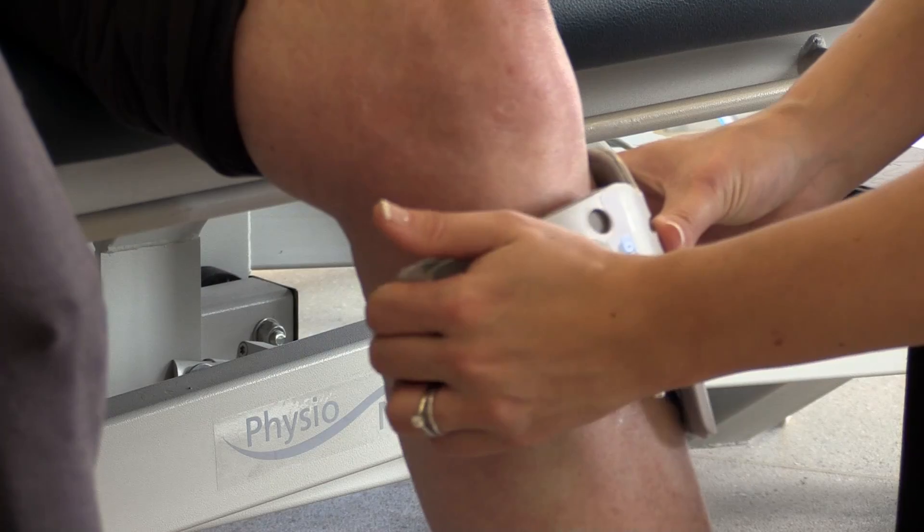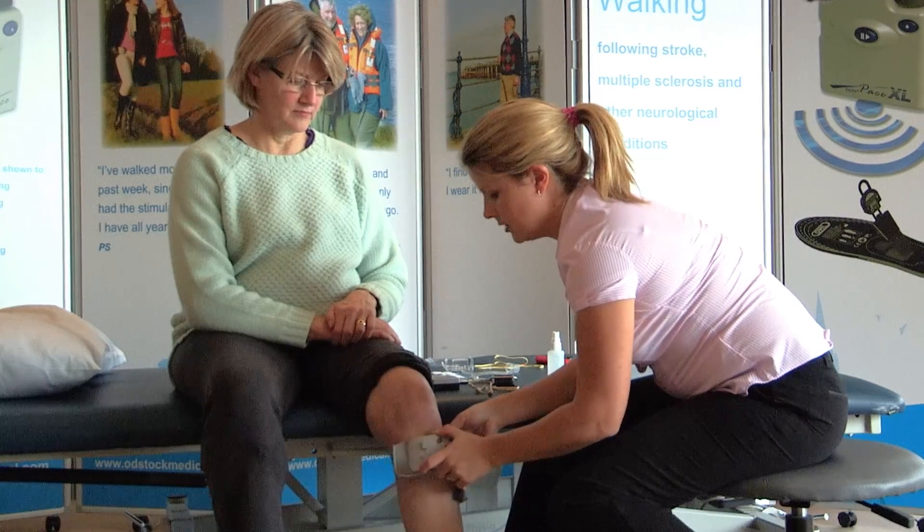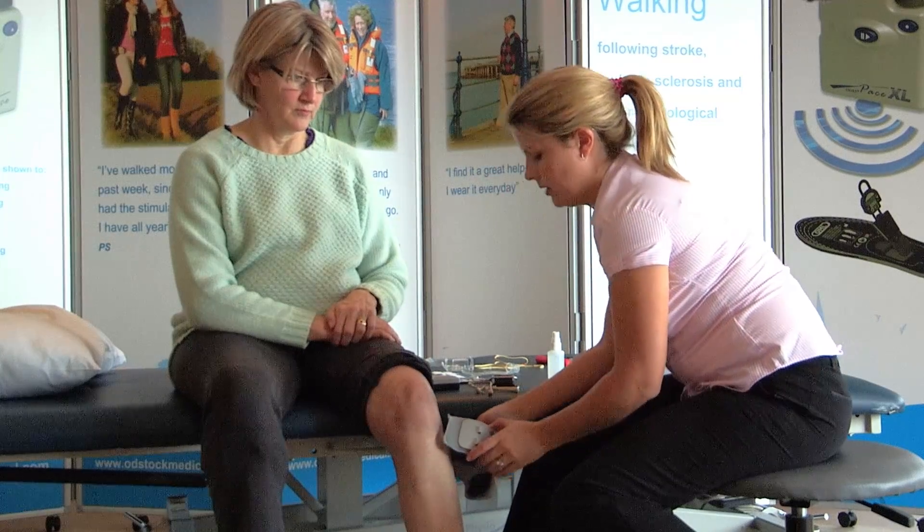Once you're happy, gently peel the leg cuff off the leg, encouraging the electrodes to come away with the leg cuff.